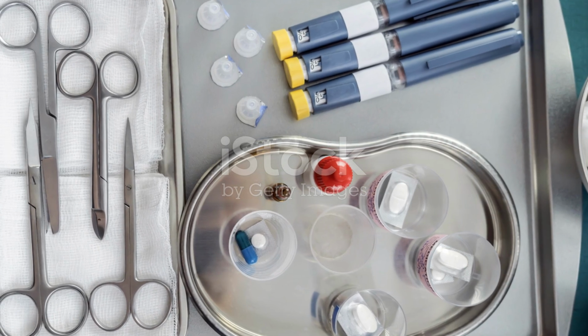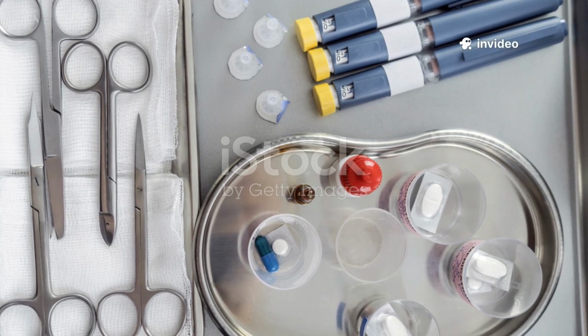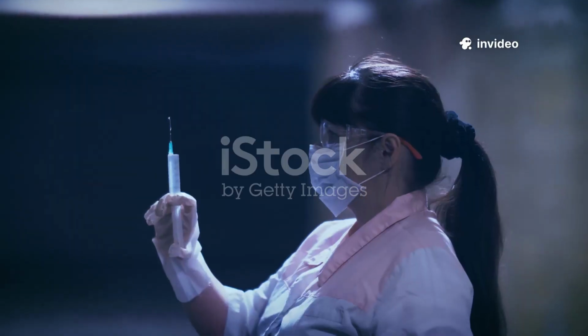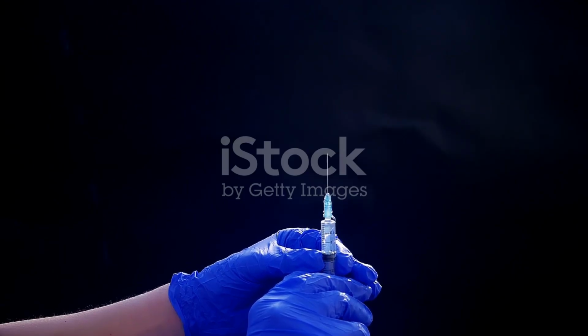Equipment required includes sterile syringe, needle, prescribed medication, alcohol swab, cotton ball, and gloves. Explain the procedure to the patient. Check doctor's order and medication. Perform hand hygiene and wear gloves.